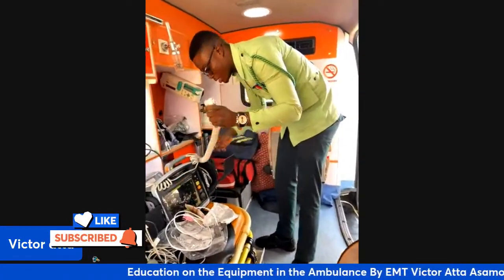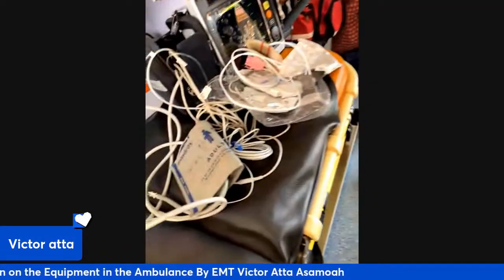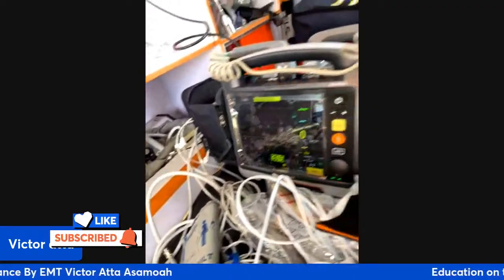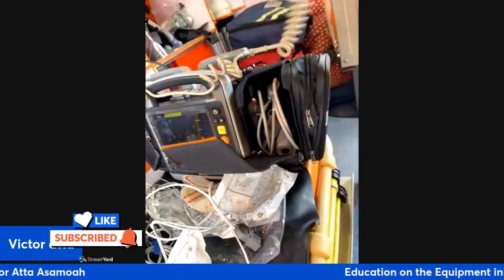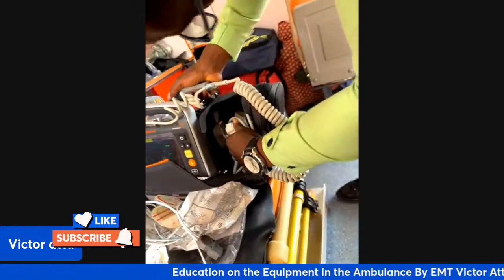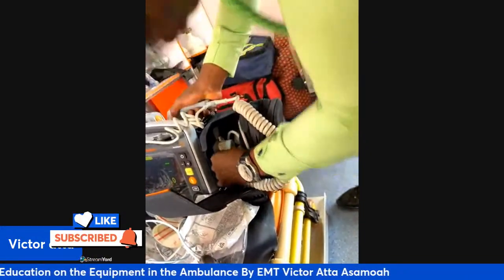And here is the connector. We connect the electrode parts or the shocker parts to the machine before you start using it.